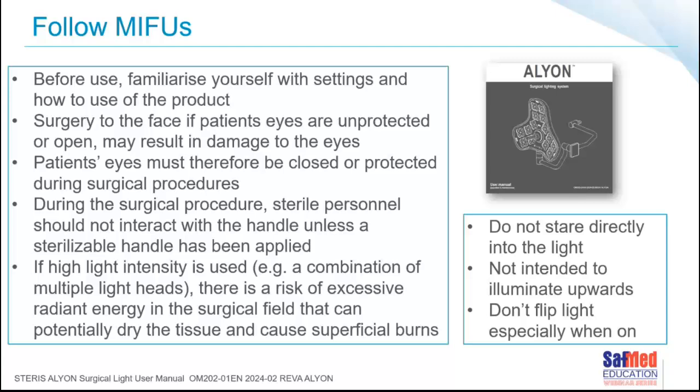It states quite clearly that if you are doing surgery to a patient's face and the eyes are unprotected, there's a good chance that you could damage the patient's eyes. Therefore, the eyes must be closed or protected during surgical procedures. Thankfully, we all do know that. During the procedure, also quite obvious in this instructions for use, but I guess we have to be clear about this, they remind you that sterile personnel should not touch the handle unless you have a sterile handle attached. And importantly, if high intensity is used, i.e. a combination of multiple light heads, there's a risk of excessive radiant energy in the surgical field and it can potentially dry out tissues and cause superficial burns.